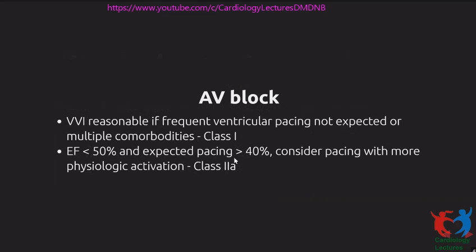In patients with AV block, obviously there is no role for AAI pacing. So here usually the decision to make is between VVI, VDD, and DDD pacing. Generally, DDD, dual chamber pacing, is preferred over VVI pacing because it seems intuitive that you're giving them synchrony, and that should result in improvements in their effort tolerance and functional class. But it's somewhat surprising when you look at the evidence that there's no good, strong evidence that DDD provides better functional outcomes compared to VVI pacing in these patients.